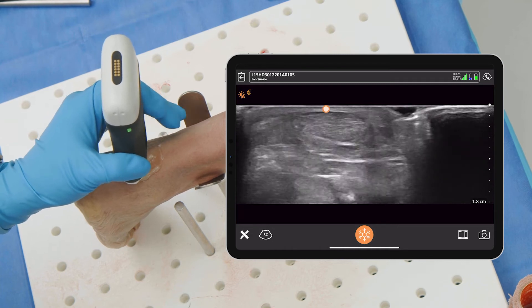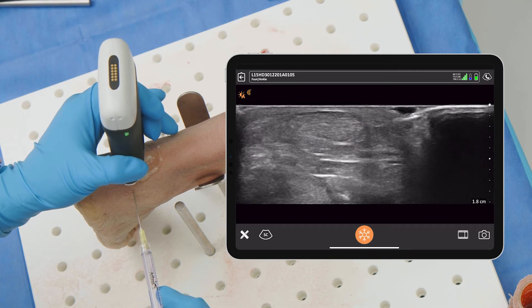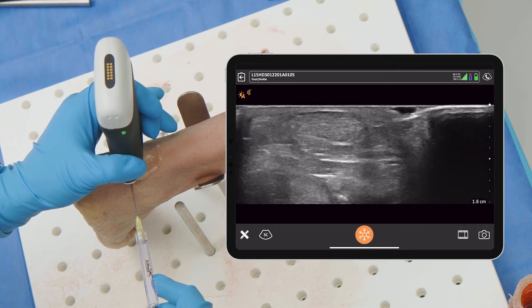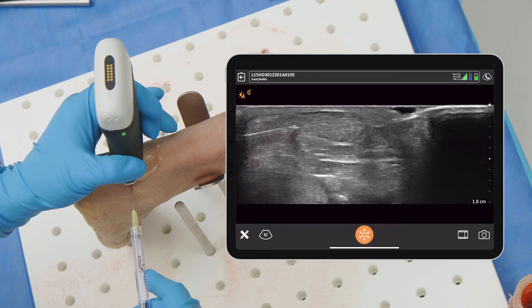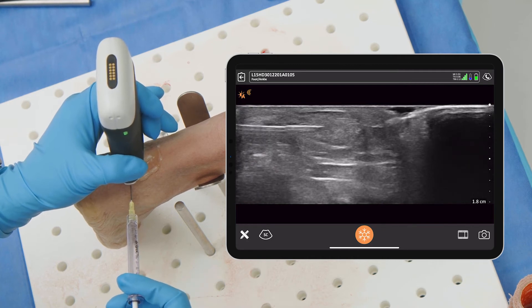Once you've localized your area, coming in-plane short axis, coming straight into the tendon, we can get right into the tendon and then deliver whatever biologic you want to the tendon itself.